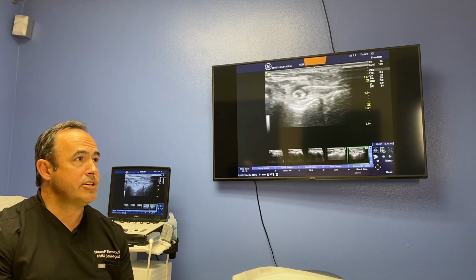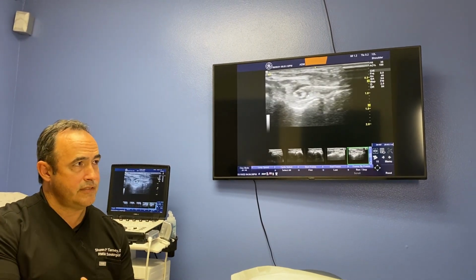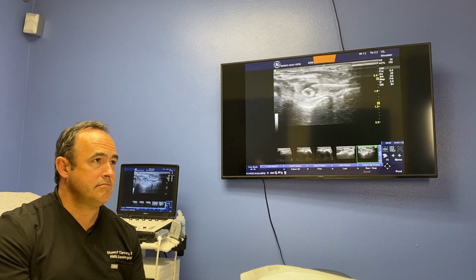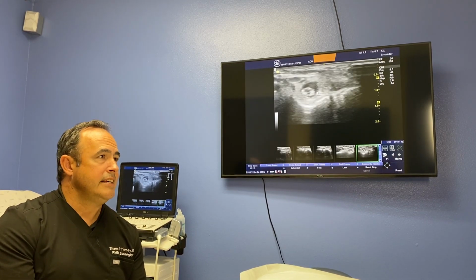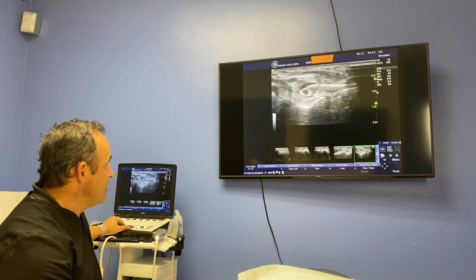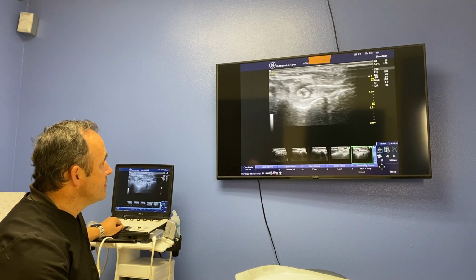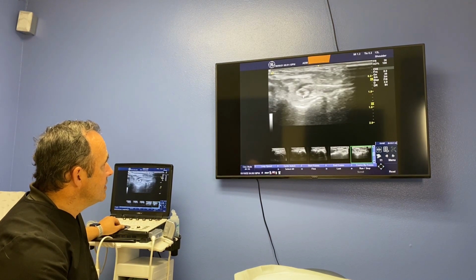So we have a lot of nerves that, as anatomical specialists in musculoskeletal ultrasound, we have the ability to look at, isolate. Now what you're seeing on the screen here is a cross section of the nerve. So you're not seeing the nerve in long axis. So it's like the nerve is cut, like if you cut a shoelace. Now if you notice, that nerve is not as small as you might think a nerve root might be. You can see that's about 3 or 4 tenths of a centimeter in cross-sectional diameter. Another reason I can say that is you look over to the side here, and I can measure that directly. This is 1 centimeter and this is 2 centimeters. So that nerve is probably like 3 to 4 tenths of a centimeter in cross-sectional diameter, versus maybe 3 tenths of a centimeter in shorter axis diameter.